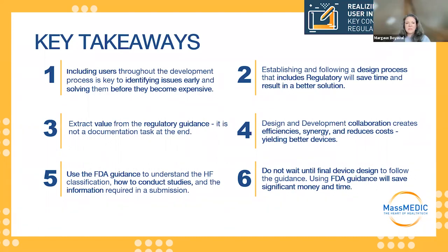Two, from a design perspective, developing and following that design process and collaborating with regulatory will definitely save you time and get you a better solution. Three, extract your value from your regulatory guidance. Counterintuitively, it actually helps foster some brainstorming and thoughts when you have constraints. I see Margot's shaking her head. She knows what I'm talking about.